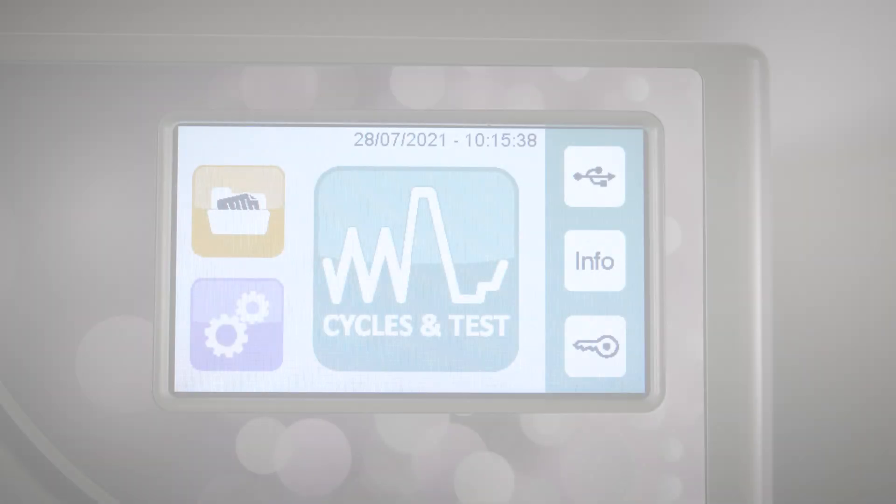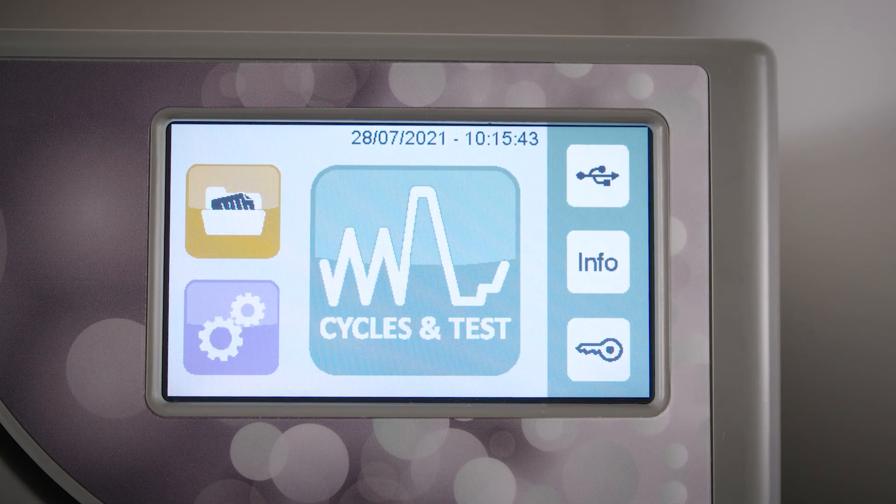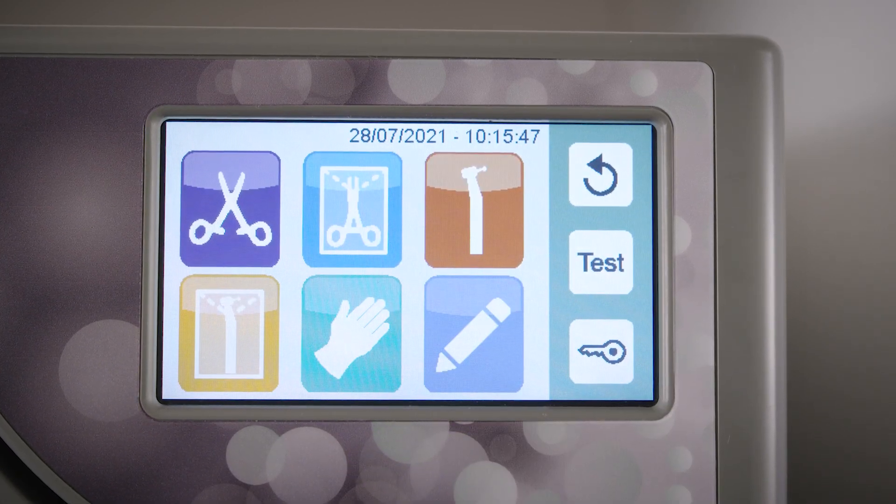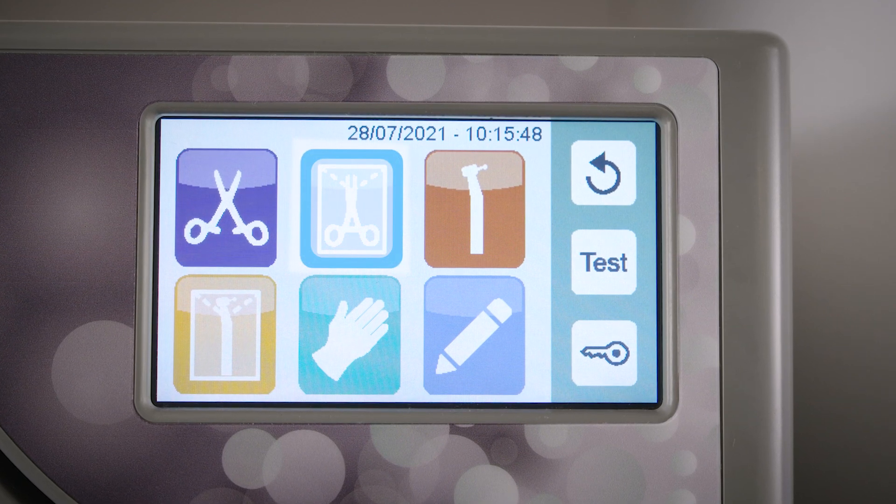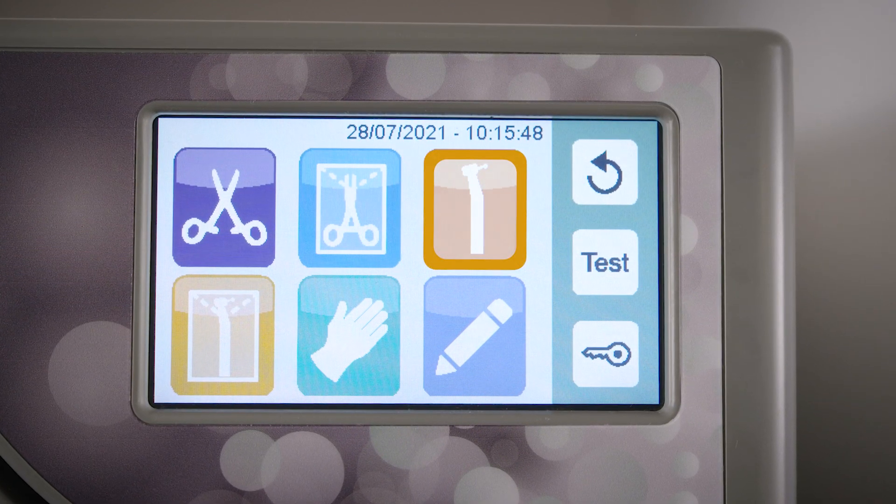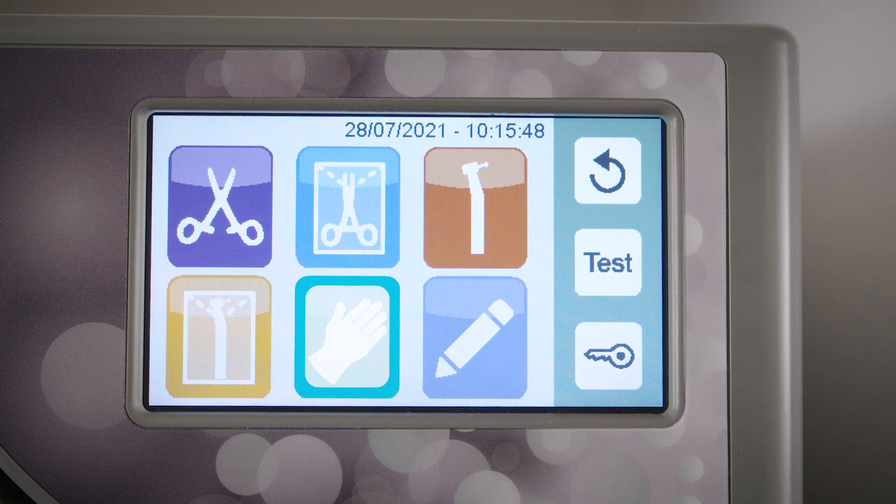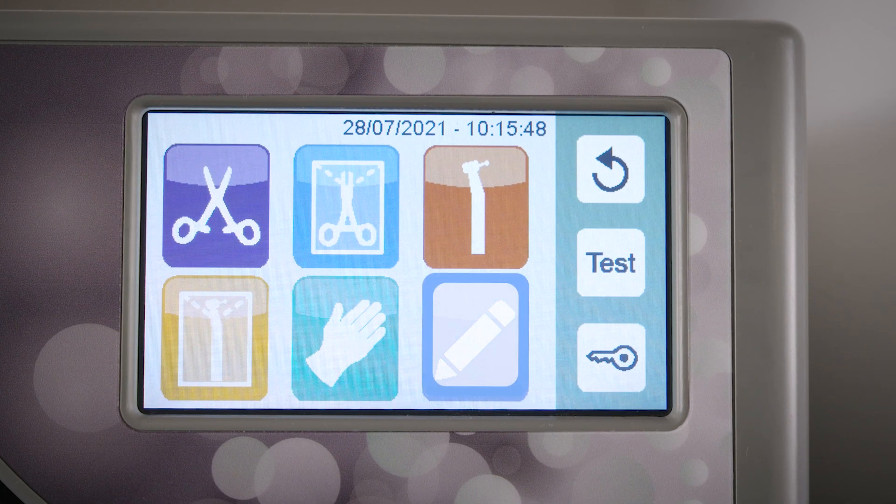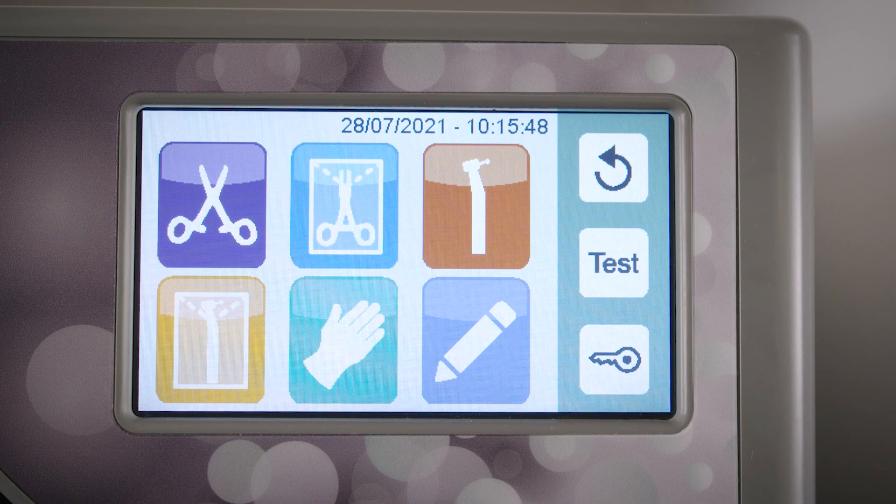The cycles and test icons give you access to the Bravo G4's sterilization and test cycles. The Bravo G4 offers five validated cycles including Solid Unwrapped, Solid Wrapped, Hollow Unwrapped, Hollow Wrapped, and Rubber and Plastic Cycle. In addition, a user-defined custom cycle is available. Please consult the operator's manual for more information about the custom cycle.